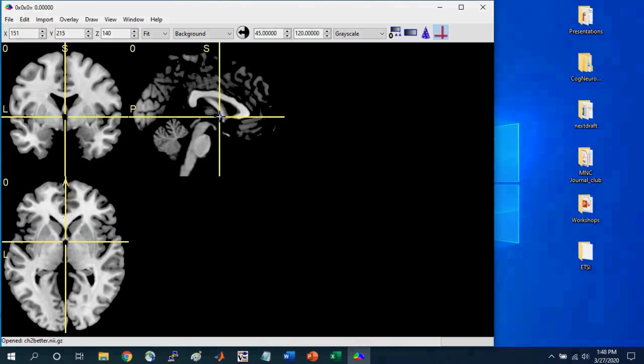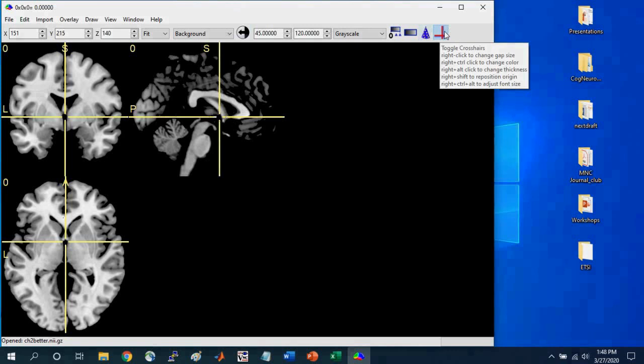So if you hover over this again, you can Ctrl-right-click, and you can change the color of these crosshairs.